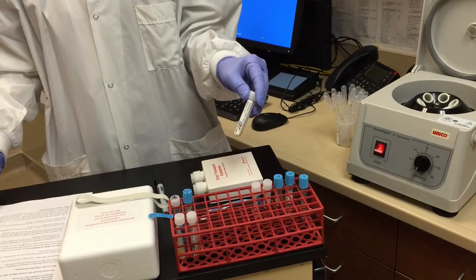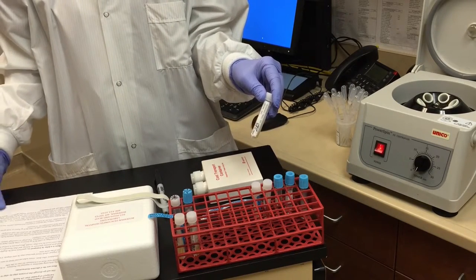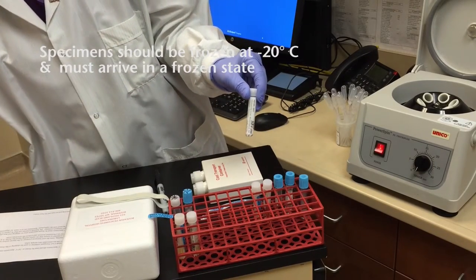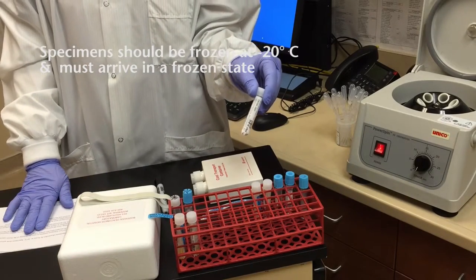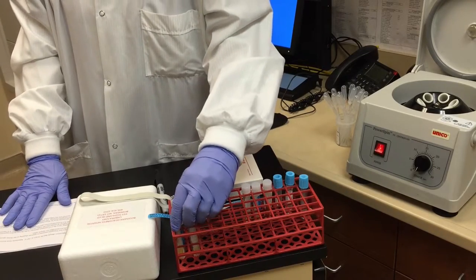The number of tests ordered will determine the number of aliquots needed — generally one or two aliquots per test ordered. The specimens should then be frozen at minus 20 degrees Celsius, and the specimens must arrive in a frozen state.